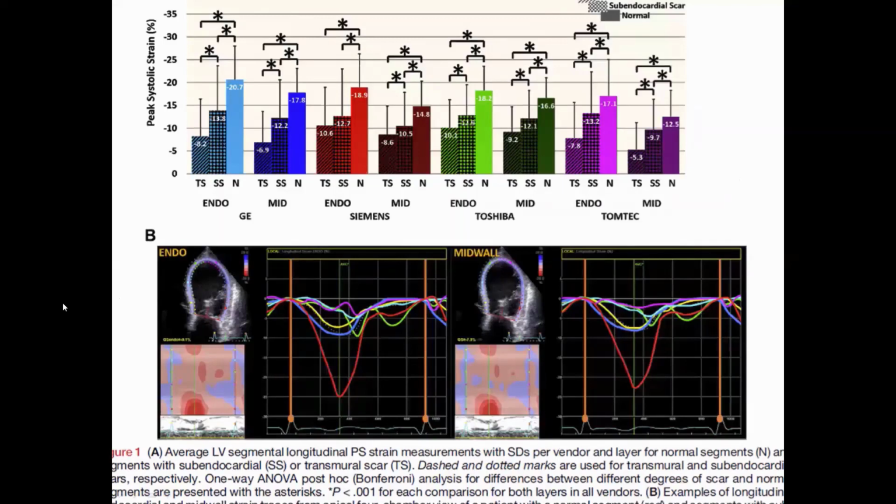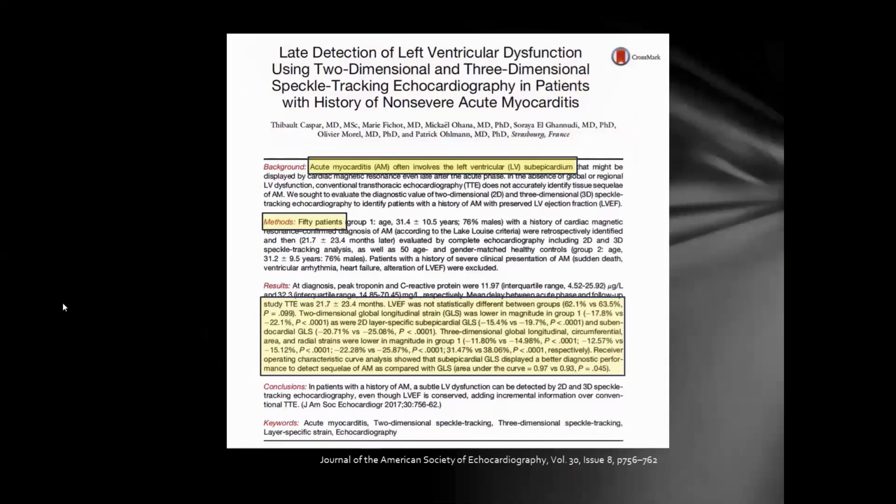Now, they'll continue to work on this, but there have been some papers. Dr. Shaw mentioned that he had done a talk for ASE University where he had shown epicardial strain correlated well with his MRI studies. So, there's work out there. It's not something we're going to do, but because we're talking about myocarditis in a normal world also, this is some work that will continue and hopefully continue to improve to give us more data that echo can offer.